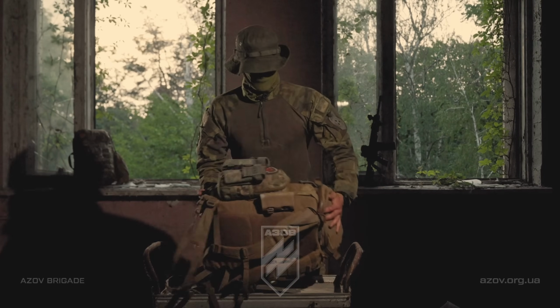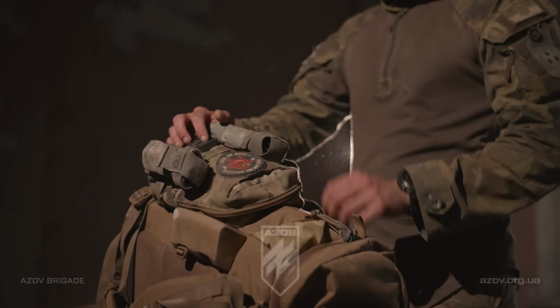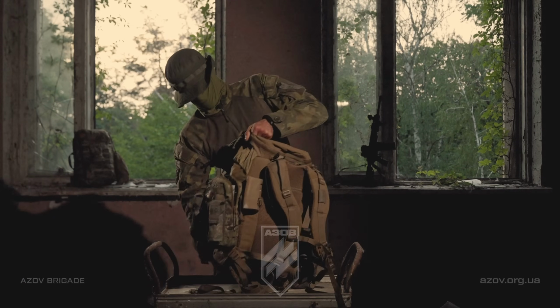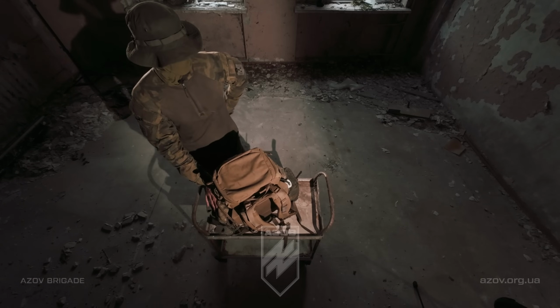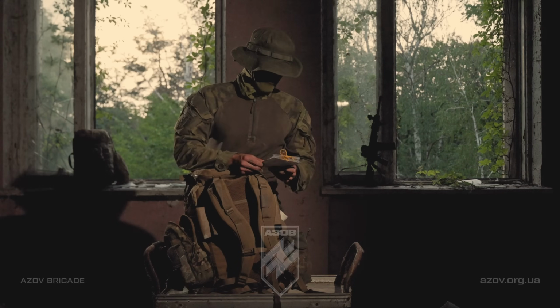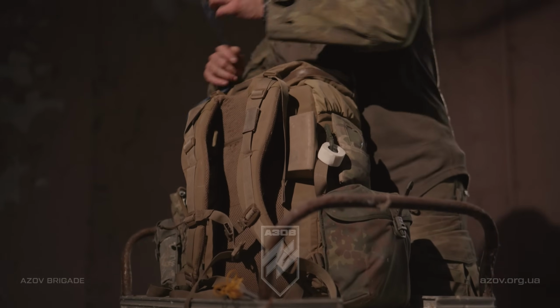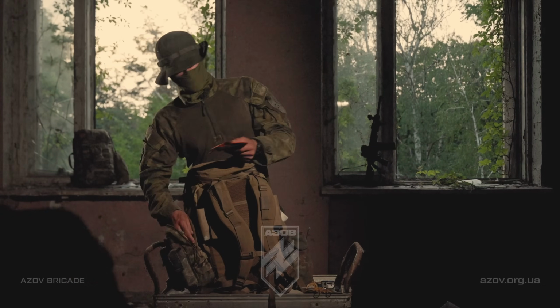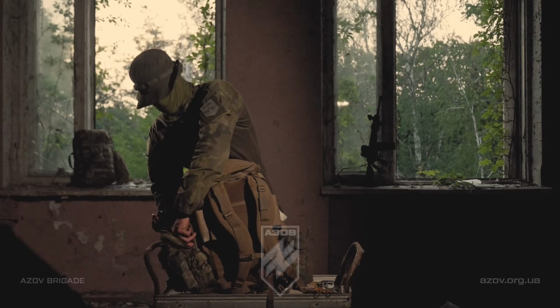Okay, coming over to this other pouch here, you're going to see I have 3 tourniquets on here. This is where my shears used to be, but unfortunately they got ripped off going for a tree line. Going inside the pouch. The reason I have 3 tourniquets on this pouch is they're at hand, easy to use, but I normally carry another 4 in my belt kit, which is for other people. I carry 8 total. So in this pouch you're going to find I have my casualty cards, my SpO2 monitor, and I'm going to have hypothermia treatment here in the form of hand warmers. This is just some of the treatment I use. Oh, and I also got my stethoscope there in case I need to listen to lungs.